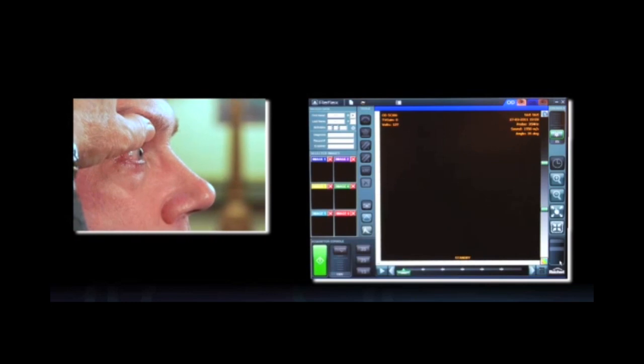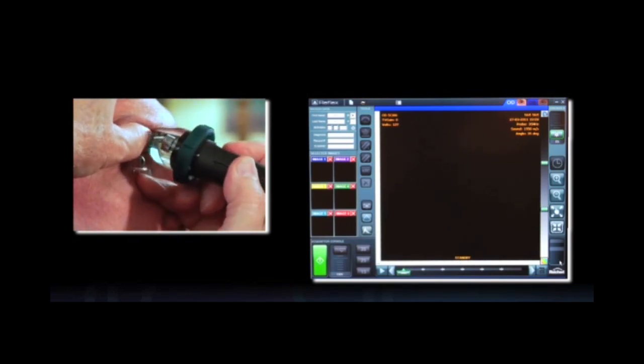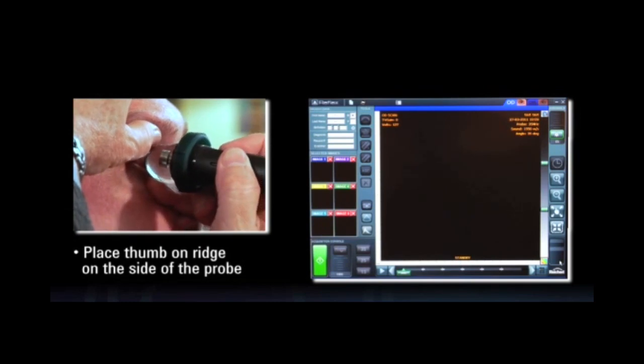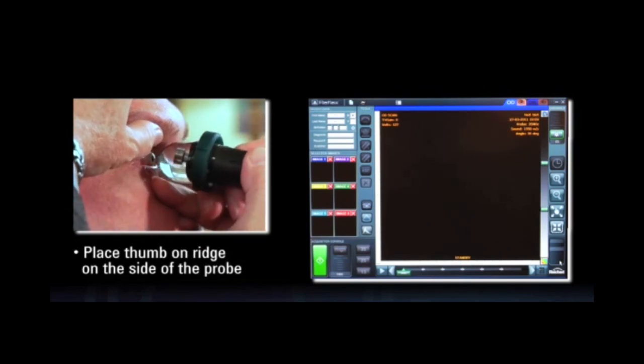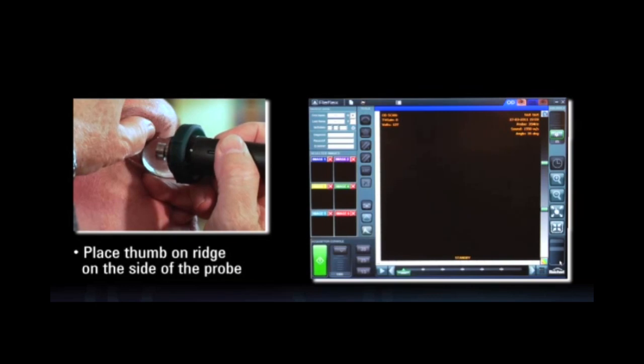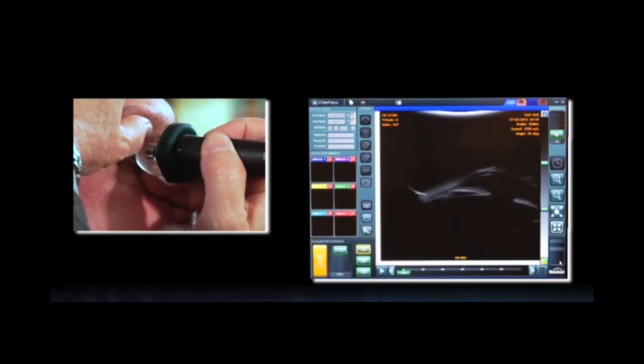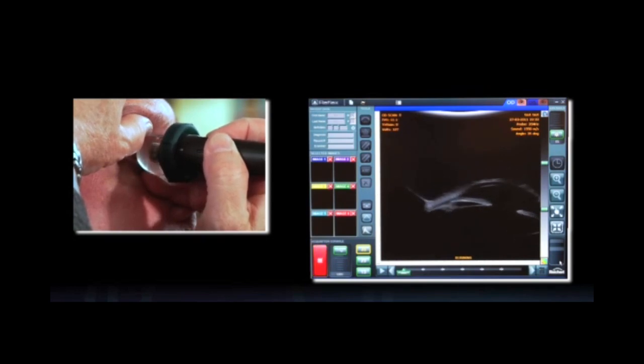Okay, look right here. I have my finger on this ridge on the side of the probe. I'm aiming very carefully, and then I'm going to look at my screen. There's as long as it took it to get an image. Stop and freeze that.